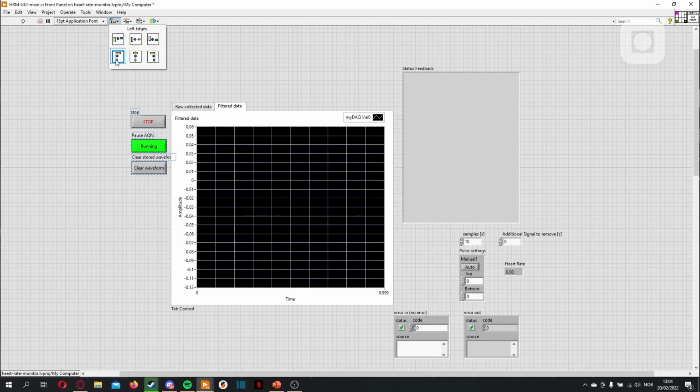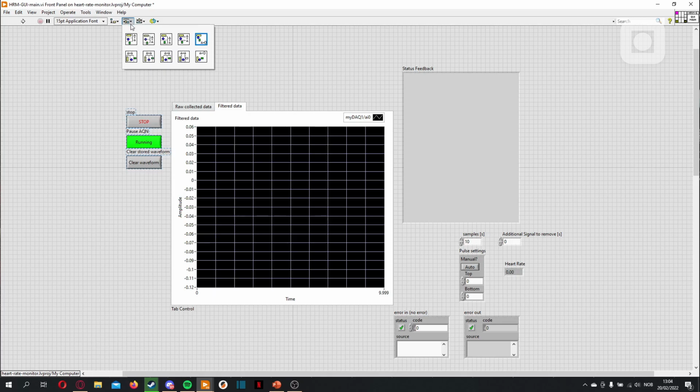We can also align them by pressing this. We'll align them to the left. Remember that the text counts. And then same with this one, it just smashes them up against each other. You have a lot of different things you can do here. These ones align them to a line, center, etc. This one puts them at a certain distance. You can either have a set distance or just put them together vertically or horizontally. And this one groups them together so they can't be moved apart later.